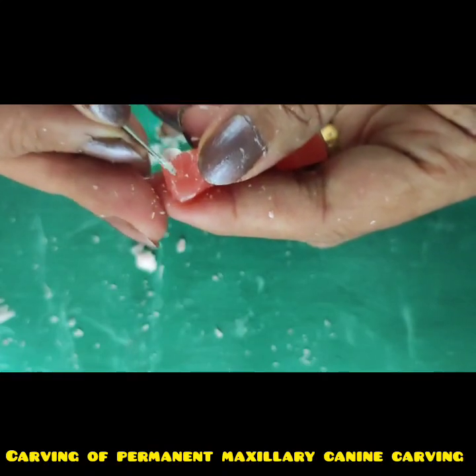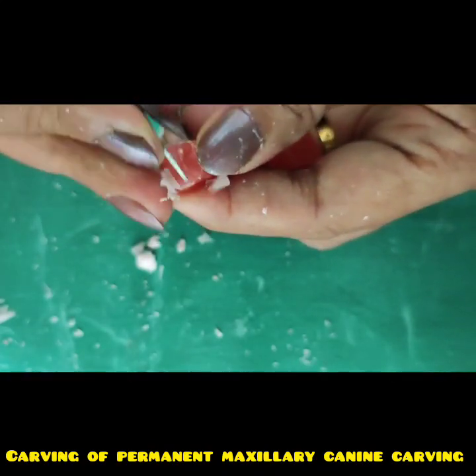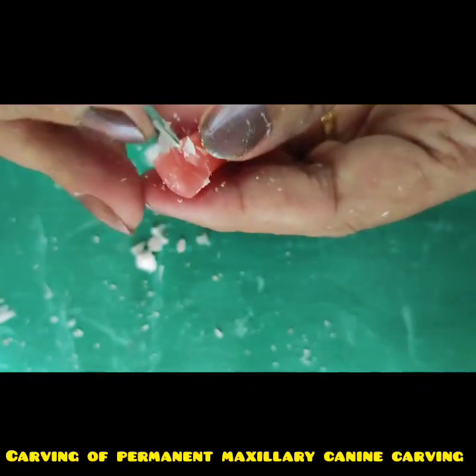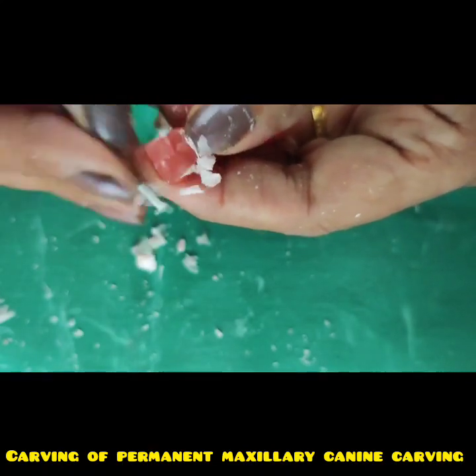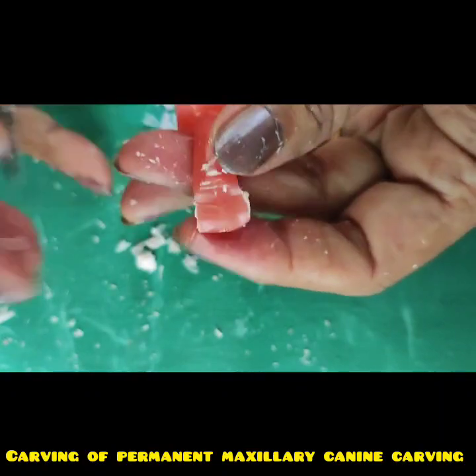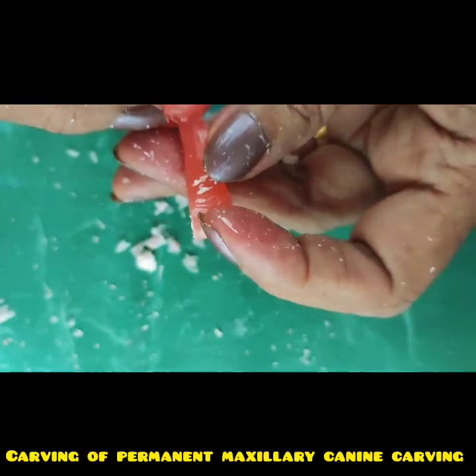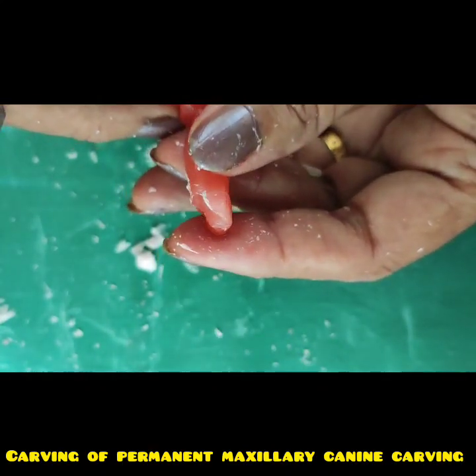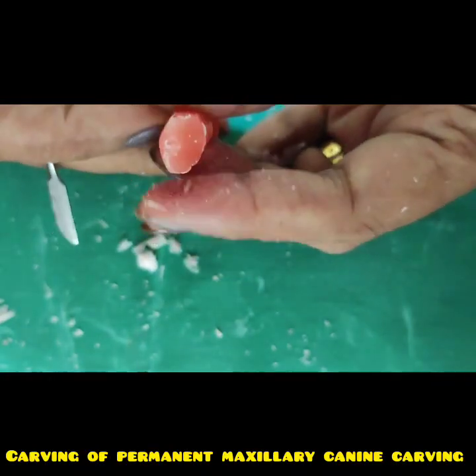Keep the central wax intact, which will be our lingual ridge, and on either side where we have kept extra wax, reduce the wax to create 2 fossa like this. You can see this is one platform, this is one concavity, and this is another, and the lingual ridge is also prominent, right?